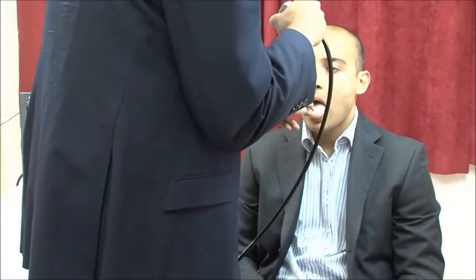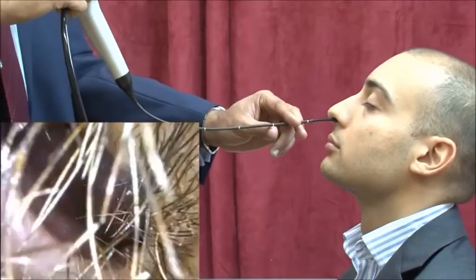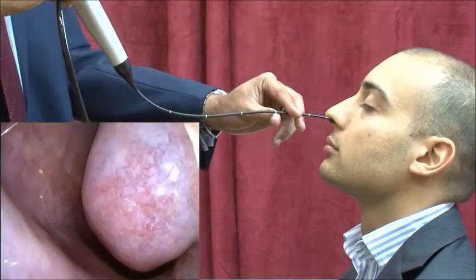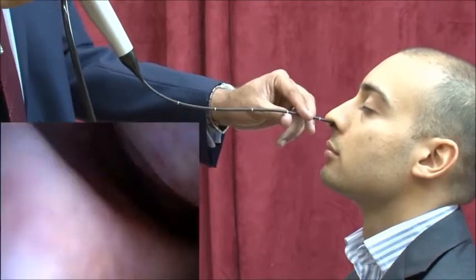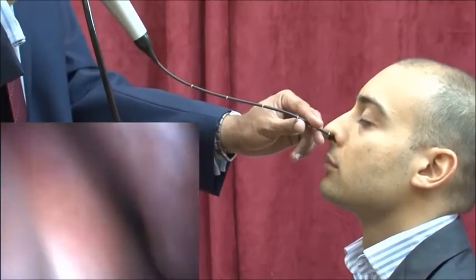So in this case, I'm going to ask a patient over here to just open their mouth, and I'm going to use the saliva as an anti-fog. So Omar, which side of your nose do you breathe better through? Through the left side, okay. Just tilt your head slightly up. I'm entering the left side of the nasal cavity, as that's the easier side. And you can just see over there on the right hand side is the inferior turbinate, on the left is the septum, and try and find a space between the two and enter towards the postnasal space.